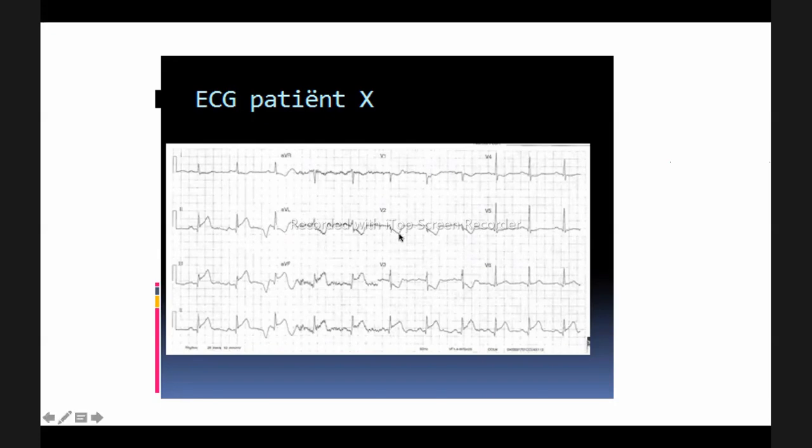Then these depressions you are seeing there are what we call reciprocal changes. So they're just opposite changes. The wall that is opposite to the inferior wall is the anterior wall. So the leads that look at the anterior wall are seeing that our friends in the inferior wall are infarcted. There is elevation, as there is depression. So it's just showing mirror imaging. That's all it's showing. I hope it makes sense, but you can ask questions later if you want.